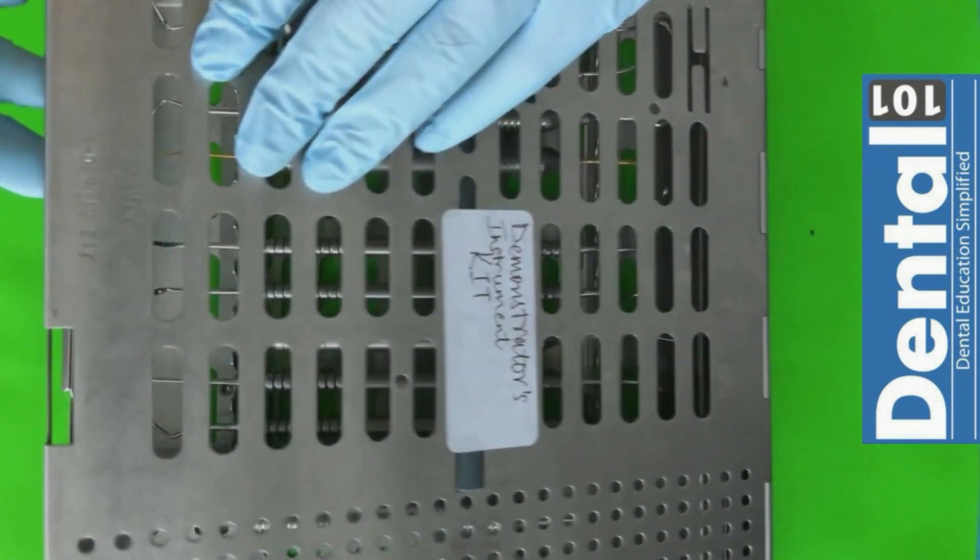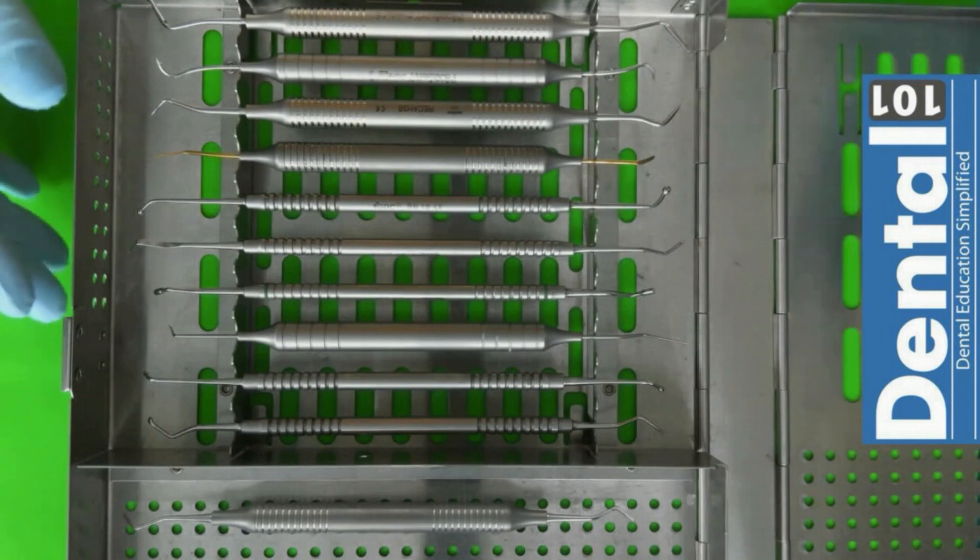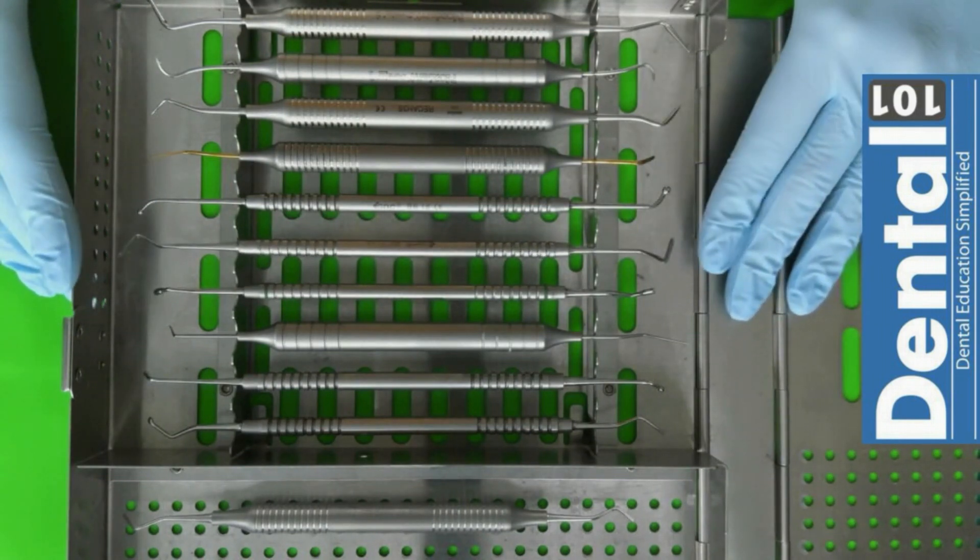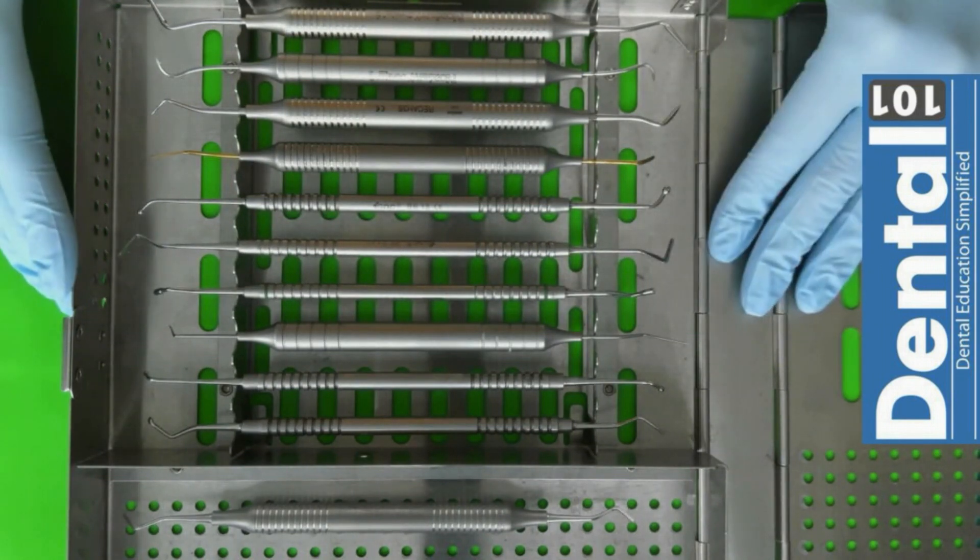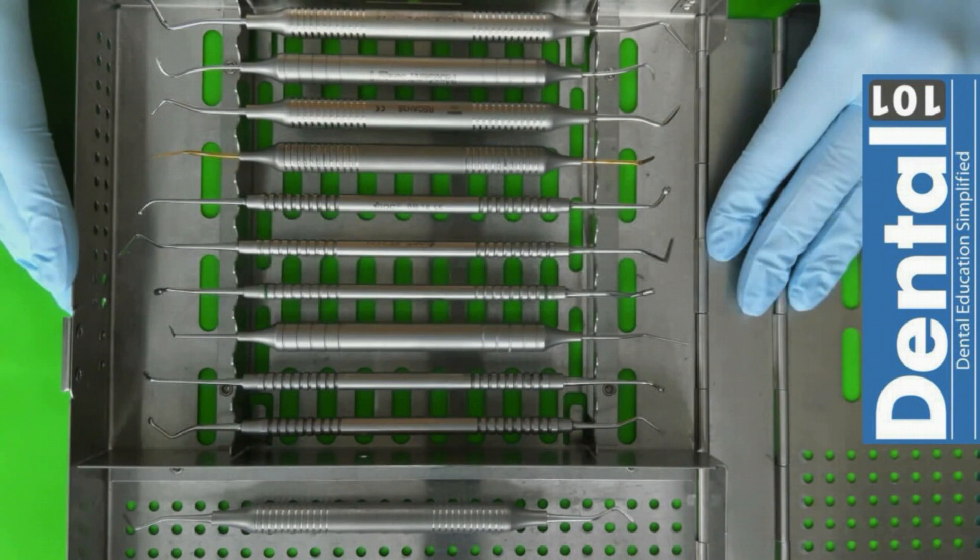If we open the cassette, remember that this cassette should always be closed. When we are going to use the instruments we are going to open the cassette and here you will see all the instruments that you are going to be provided during the exam. We are going to take a look into each instrument to revise the form, the shape, and the uses for this instrument so we can tackle all our tasks in a better manner.